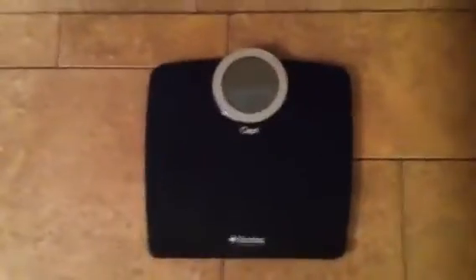Big difference compared to the old one. Very nice. Thank you, Ozeri. I love my new digital bathroom scale.